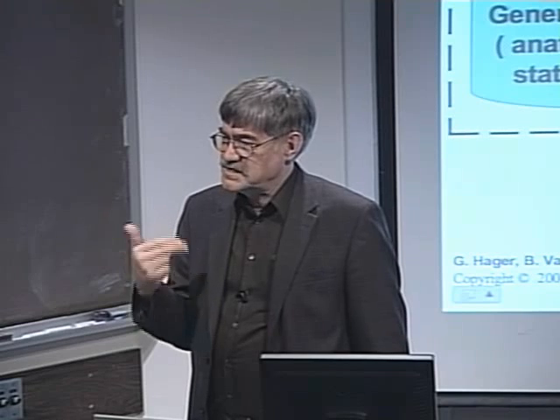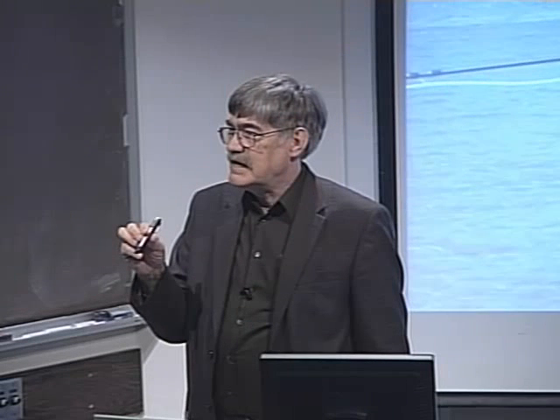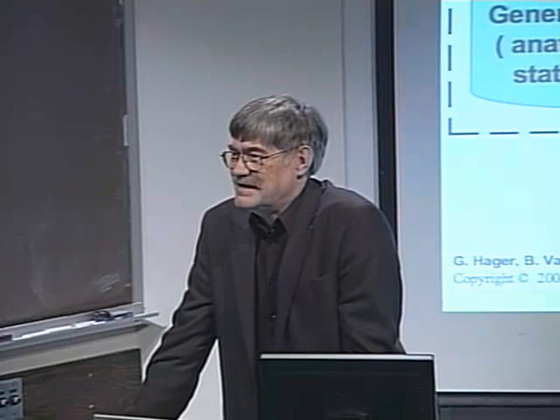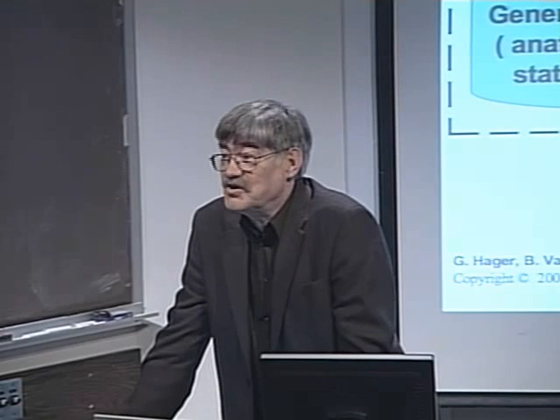But what I could still do is say, by watching how hard the guy is pushing and how fast, I think what he wants me to do is go a little faster, and I could feed that into the objective function. The way it works is you say, take whatever capabilities the robot has, subject to the limitations in the robot and the surgical safety constraints, and do as near as you can what the surgeon wants without violating these constraints. So within that context, you could perhaps do something like that. I think that's real research. How do you model intentions? How do you model the limitations of your model of intentions?